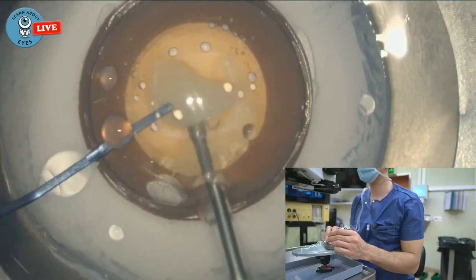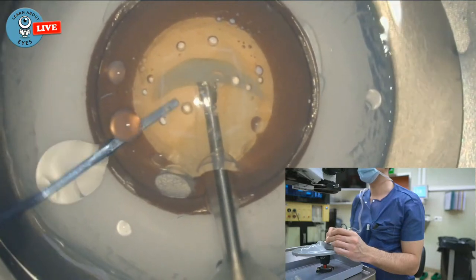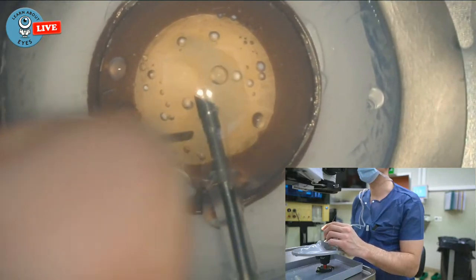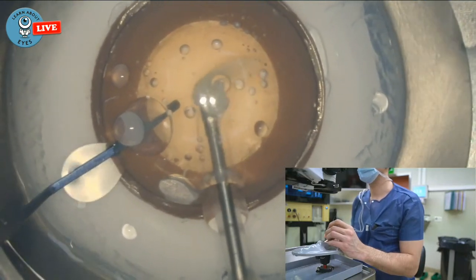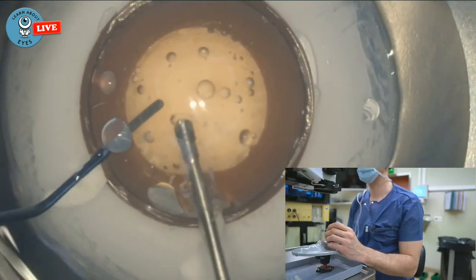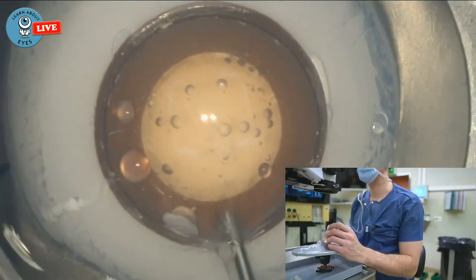I do have two phaco programs. Some people have three or four, one for grooving, one for cutting up. Just so you know, this is definitely not how you would usually do it. Well, if it's that easy, yes, you would maybe do it like that. But usually you would try and get four quadrants, not two halves. But if it's working, then you can do it this way. Yeah, there we go. And then this is already it. Let's clean these bubbles out. Nah, they're just going to stay in there forever, I guess. Okay, and then that phaco part is done.